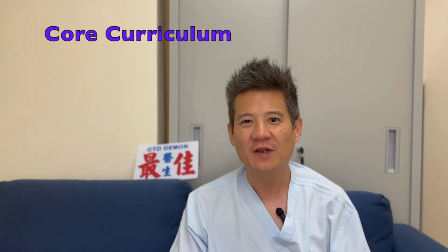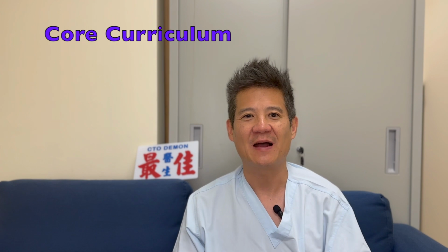Today another core curriculum talk, and we begin on a topic that I'm most passionate about, reverse CART. Reverse CART was really the thing that captured me about the retrograde procedure all those years ago. I was fascinated with reverse CART. It was so cool to be able to connect the retrograde wire with the antegrade space.